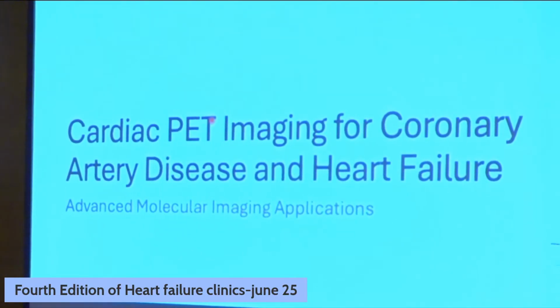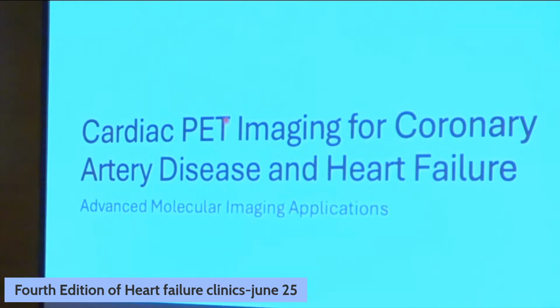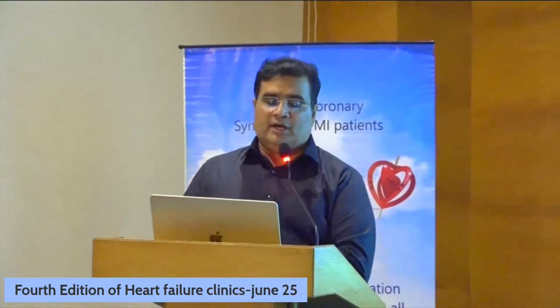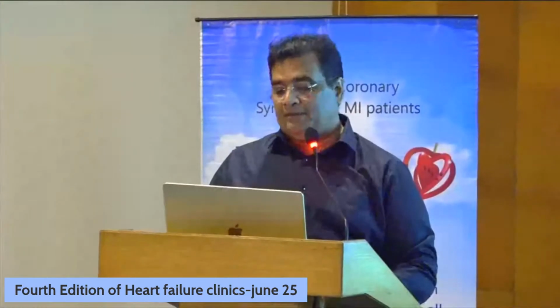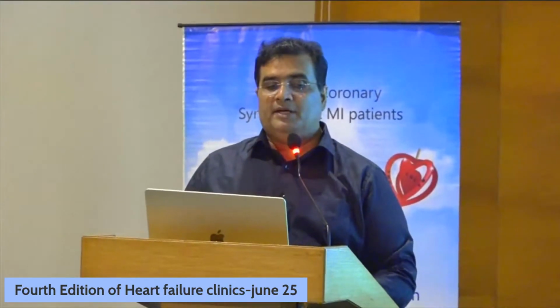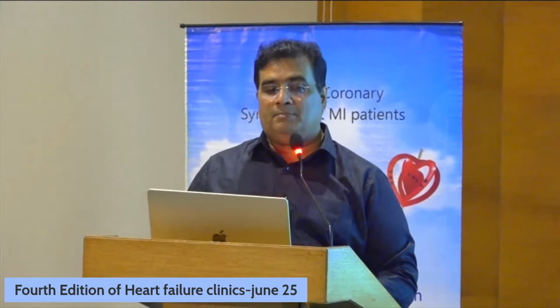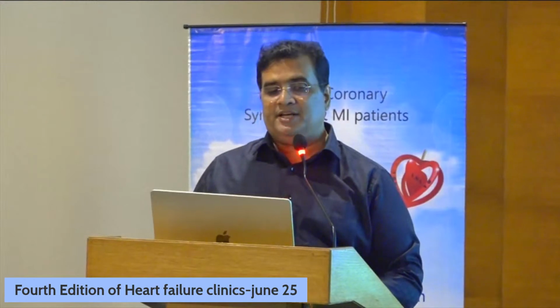SPECT has low sensitivity and low specificity. So if we do a SPECT, you underdiagnose and undertreat many patients. That was my experience for many years. SPECT did not give me very good support for decision making. Whereas with PET, you can make a very beautiful diagnostic and decision making platform. PET has better spatial resolution. It gives myocardial blood flow also, and PET has reduced radiation exposure.